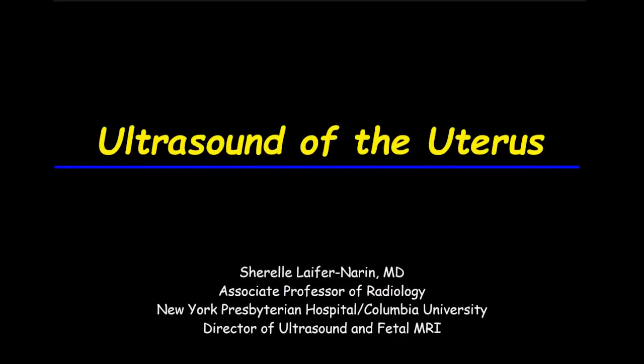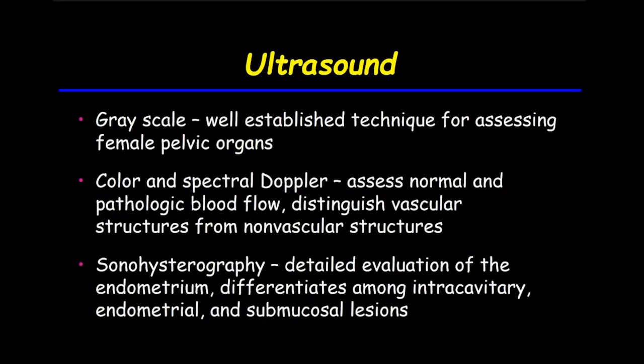Hello, I will be presenting ultrasound of the uterus. Ultrasound is a technique utilized for gynecological assessment. Grayscale ultrasound allows us to visualize female pelvic organs. Color and spectral Doppler enables us to assess normal and pathologic blood flow and distinguish vascular from non-vascular structures.